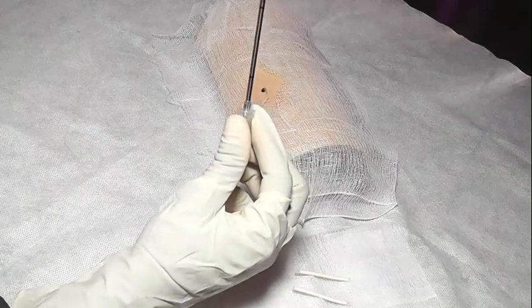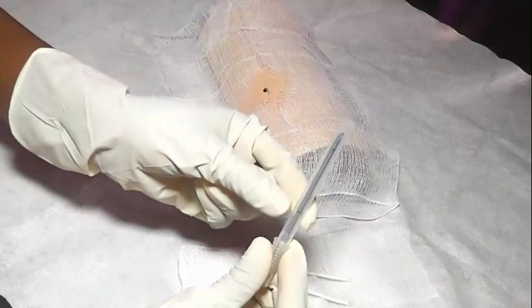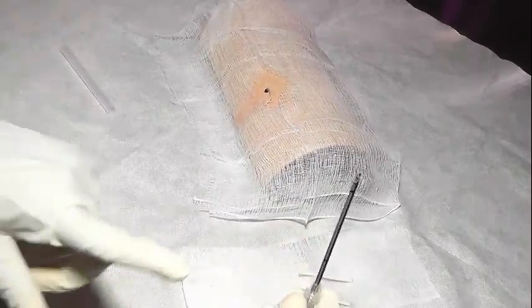Alright, so you pick the trocar. You can see that it is covered with a rubber, so you remove the cover. Now looking at the trocar, you can see that it has 2 marks.